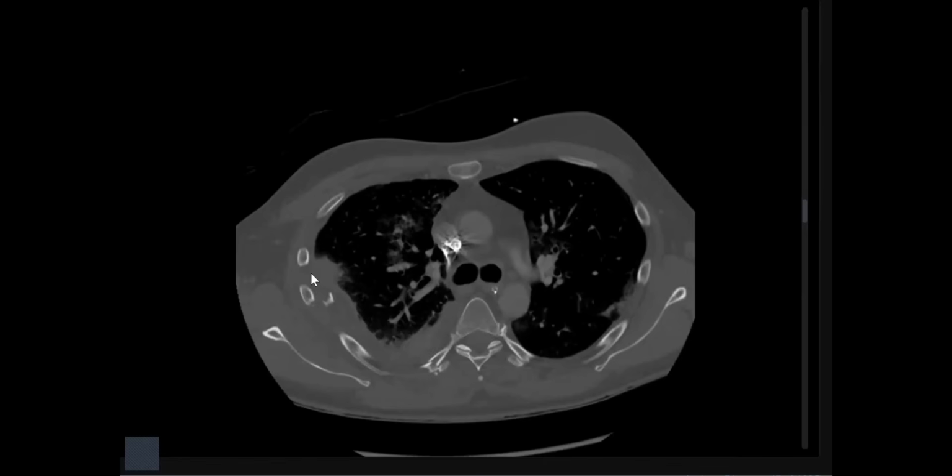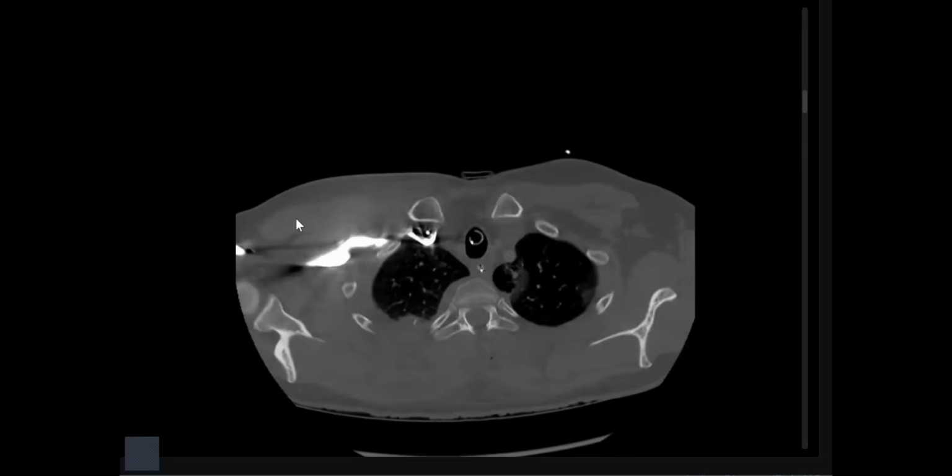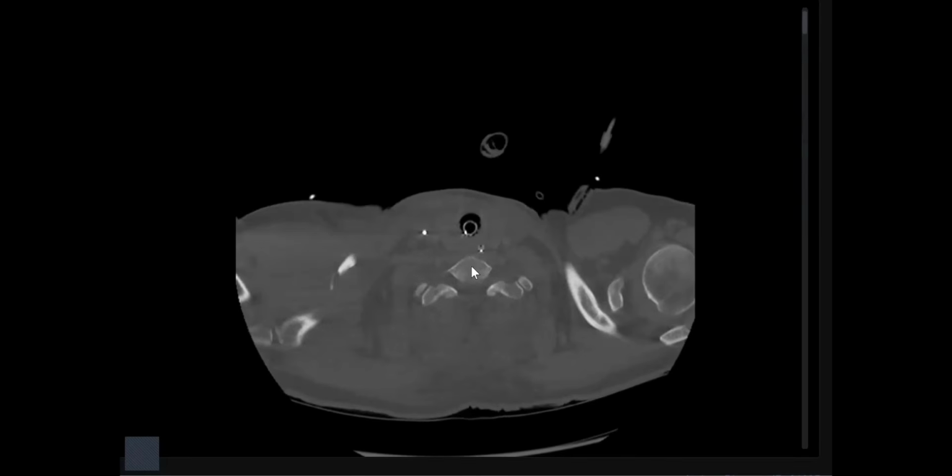It's a surgical emergency. Of course, this needs surgical fixation. A usual simple rib fracture doesn't need surgical fixation, but flail chest needs surgical fixation, with plate and screw. Okay, thank you, my friend. Well done.